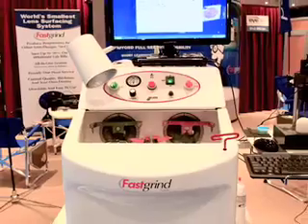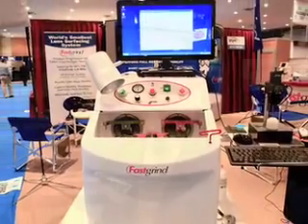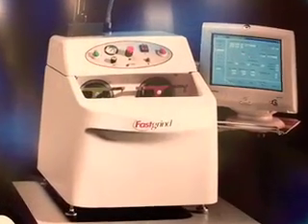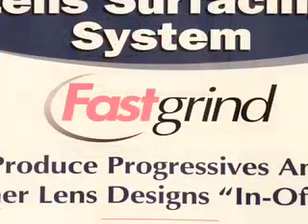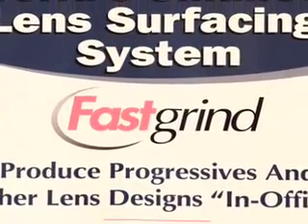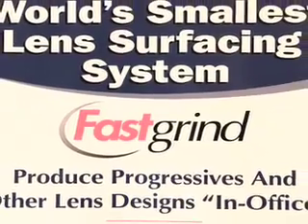Fast Grind is a compact lens surfacing system that was developed for the small independent retailer to allow them to make digital quality lenses — a digital quality progressive and other lens designs, bifocal, single vision — without the need for all the large costly equipment. Fast Grind will fit in almost any lab because it only requires a 2x2 area, just tap water and standard electric, and they can make their own lenses.